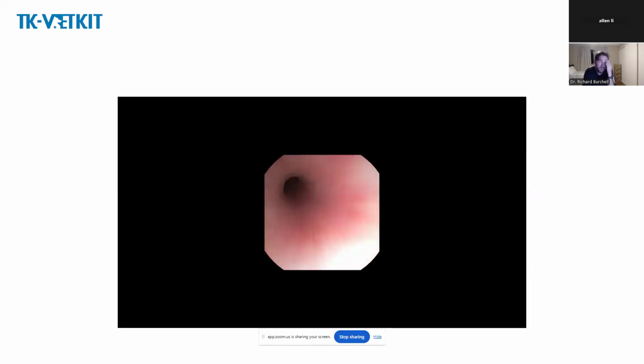You can see the urethra dilating and contracting as we're feeding it with saline. Now we're going to continue to feed the scope and follow the urethra. You can see the curve over the pelvis into the pelvic urethra. So we're now moving into the pelvic urethra. This is a border collie, so it's a relatively large male dog.